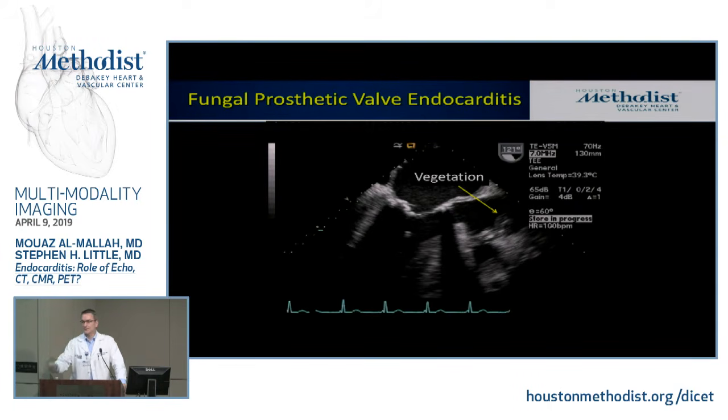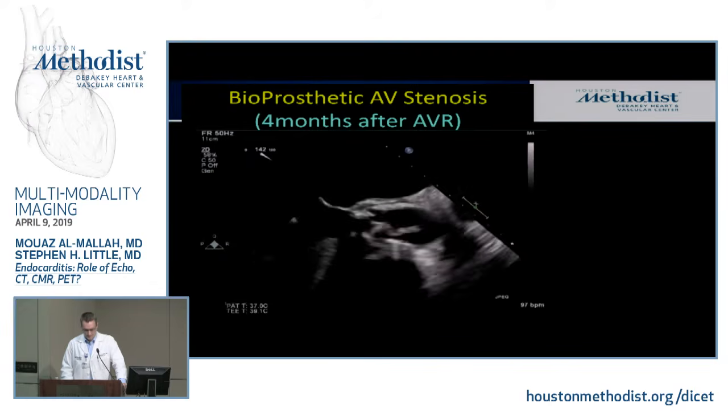So presumably an actual intraoperative contaminant that took 4 or 5 months to come to that size. But it was missed on all the transthoracic imaging, evident on the TEE. So we know that there's a fairly low threshold to do a TEE whenever there's prosthetic material and a concern for endocarditis.